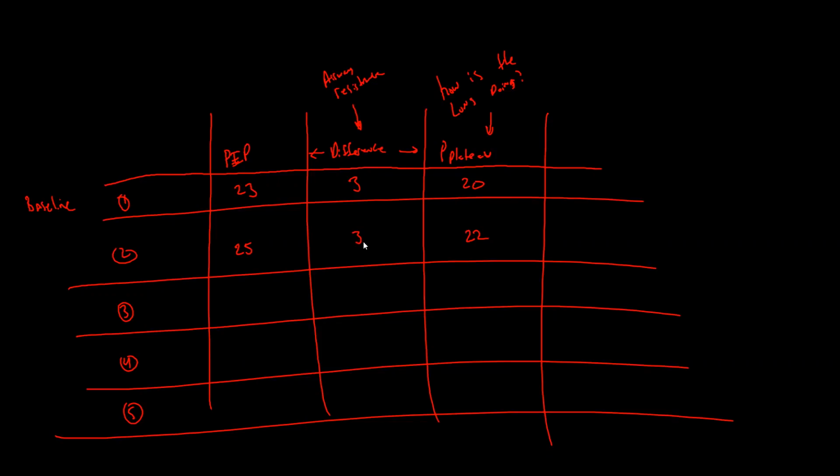Repeat that again, because I think he's staying the same because of the difference. Okay. So you think the airway resistance is staying the same? Is that what you said? Yes. Okay. And do you think the patient's getting sicker, better, or staying the same? He's getting sicker. Okay. And you're correct on both of those.